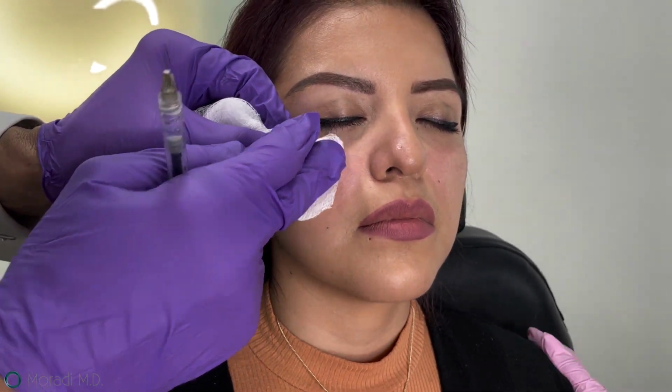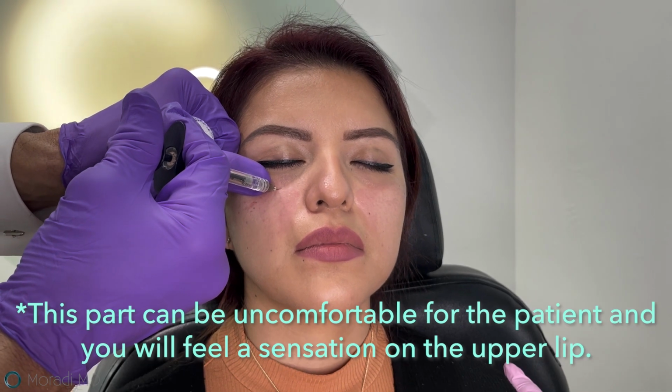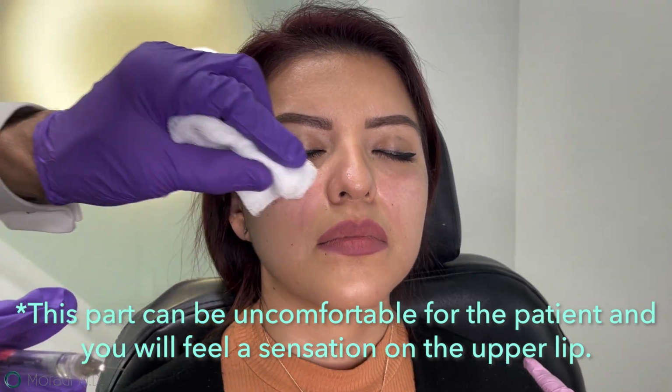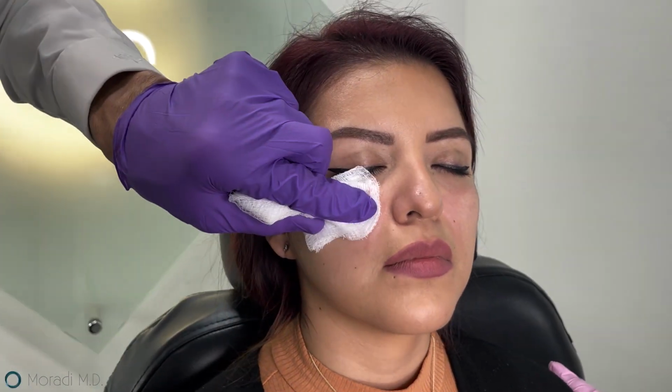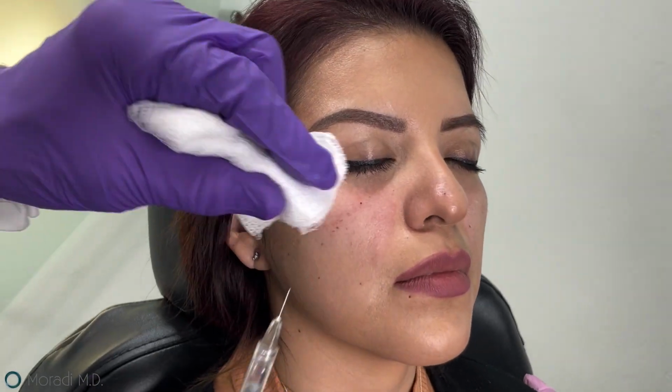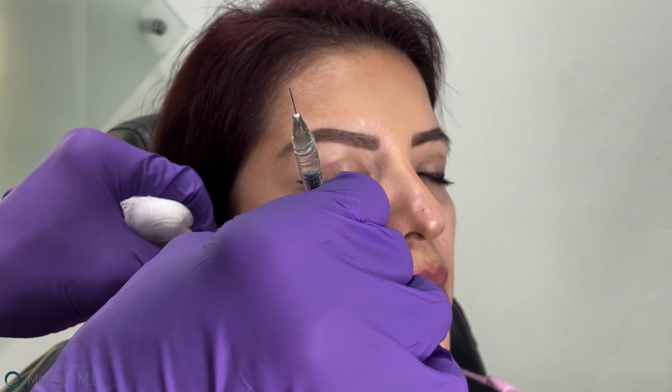Especially arterial walls are a bit thicker, therefore you should be able to, to a certain extent, feel some resistance encountering that. I'm right on the periosteum. Sometimes this is uncomfortable for the patients. You may feel a sensation towards the upper lip because the infraorbital foramen is very close by. We can see how this area is becoming more even. So I want to make sure I focus in this area.